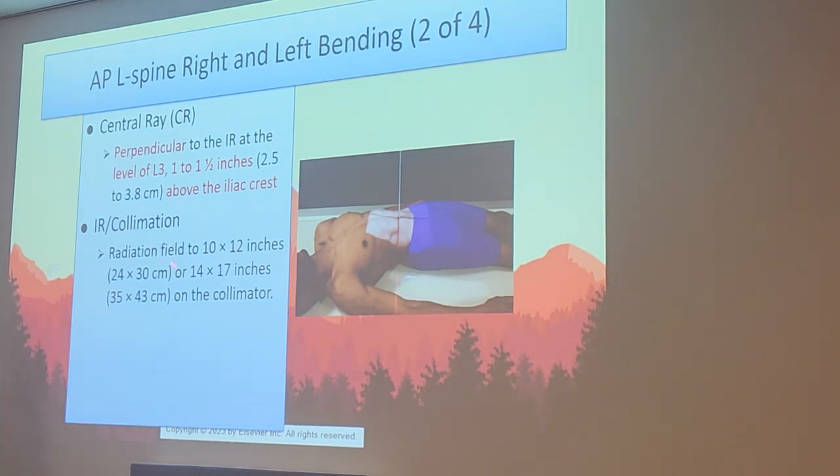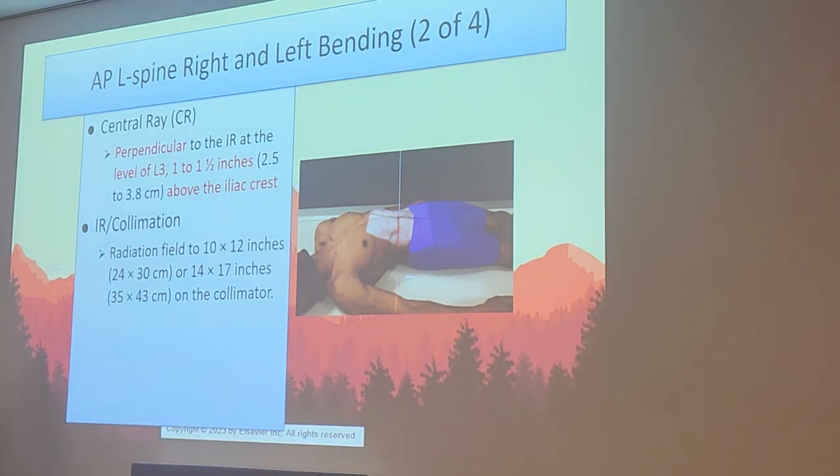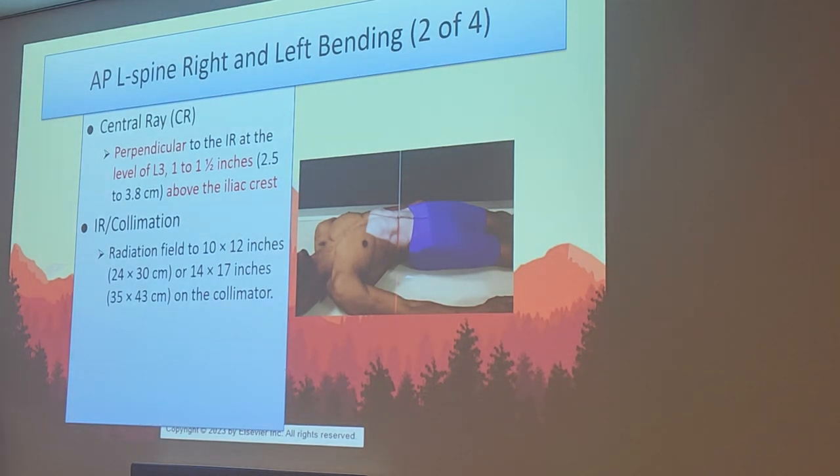And then technically, they're suggesting that you can leave these open. So your tech will be very happy about this. They can leave it open, either in a 10 by 12 or 14 by 17. Typically, you're probably gonna go with a 14 by 17 to cover that entire L spine. 10 by 12, to me, is going to cut it too close.